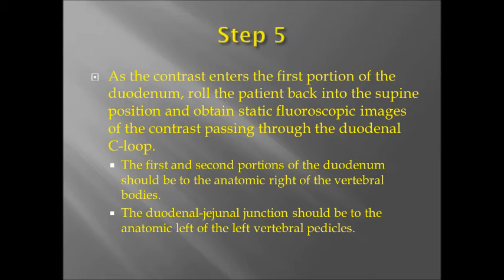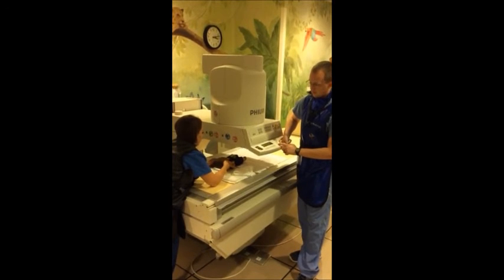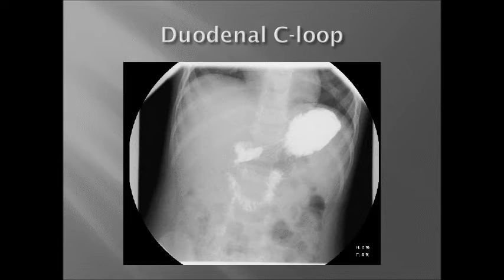Step 5: As the contrast enters the first portion of the duodenum, roll the patient into the AP supine position and obtain static fluoroscopic images of the contrast passing through the duodenal C loop. The first and second portions of the duodenum should be to the right of the vertebral bodies, and the duodenal-jejunal junction should be to the left of the left vertebral pedicles. Here is a static fluoroscopic image demonstrating the normal appearance of the duodenal C loop in the AP supine position.